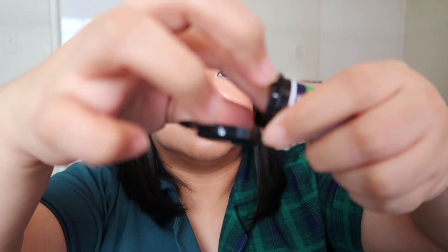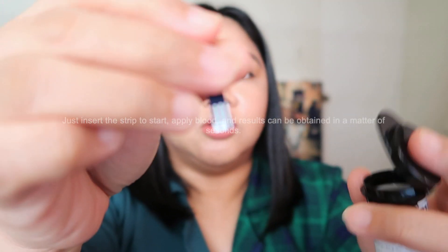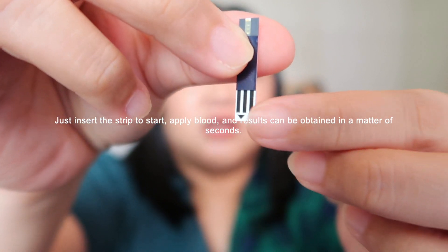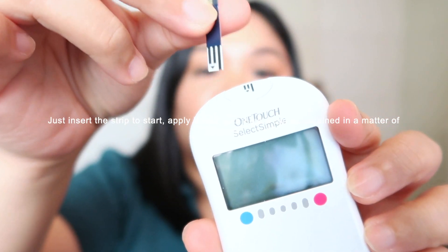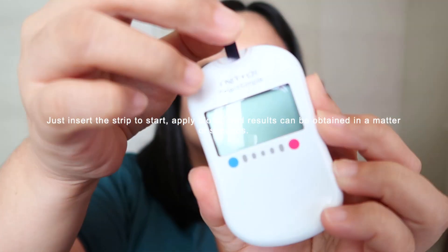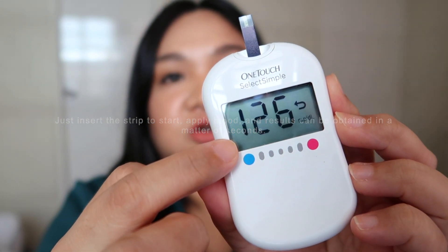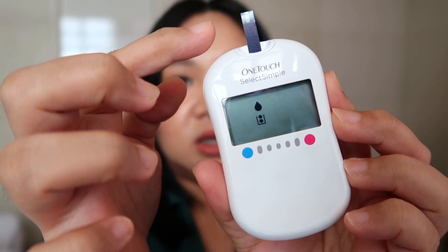Get one test strip. This is what the One Touch test strip looks like — the side with the line is what you insert into the meter. When you insert it, the meter automatically turns on — there are no buttons. It will show your last blood test result, and then when that appears, it means it's ready to receive blood.